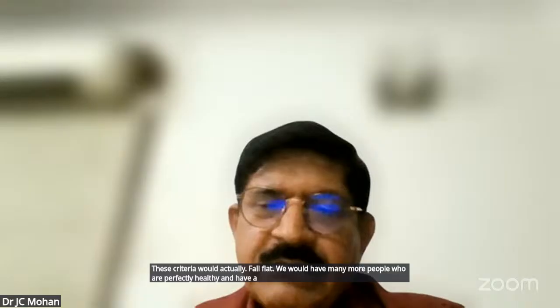We would have many more people who are perfectly healthy and have a 4 and 5, because Roxy Senior's work has shown that we Indians could have up to 1 centimeter per second less E prime, S prime and A prime. So my guess is that they focused a lot on the E prime to initiate whether diastolic dysfunction is present, but this is going to be the weakest link in these guidelines.